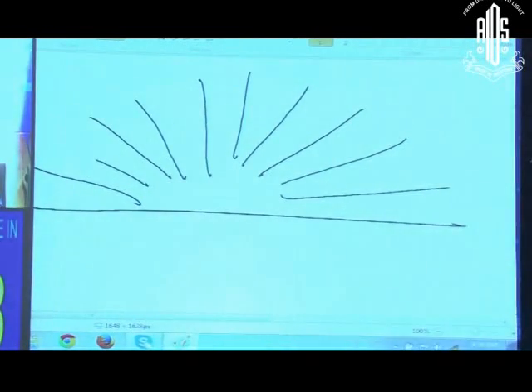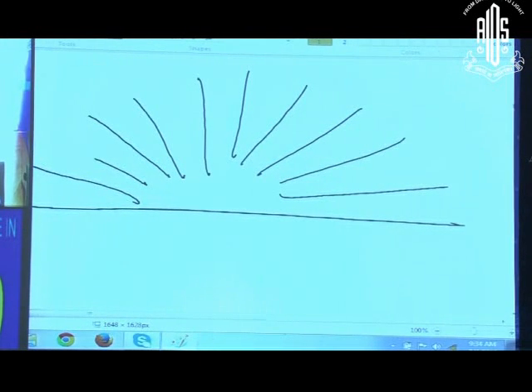Again, you have to fog the patient to such an extent that his vision is around 6/12, not complete. Imagine he's a myope, then fog him to 6/12, or correct him to 6/12. Then ask him to look at the dial, that's all, nothing else is to be put. Whichever line is clearer, you have to add a negative cylinder perpendicular to it.